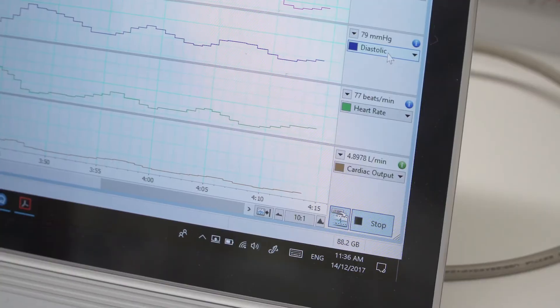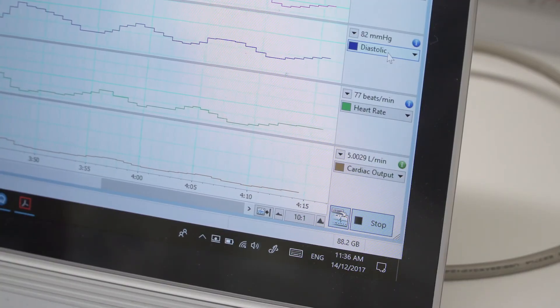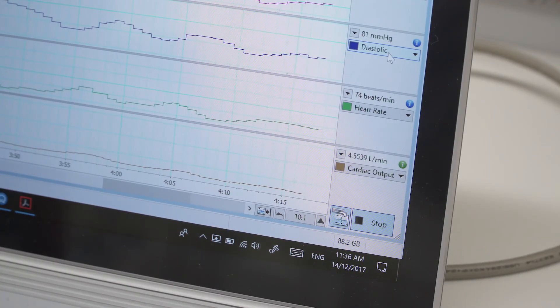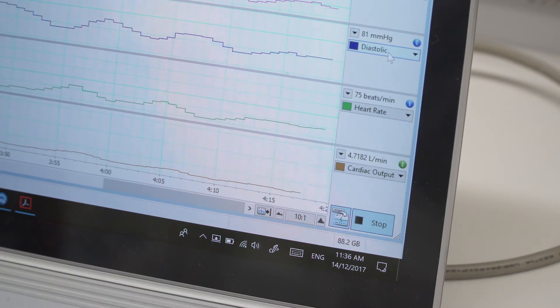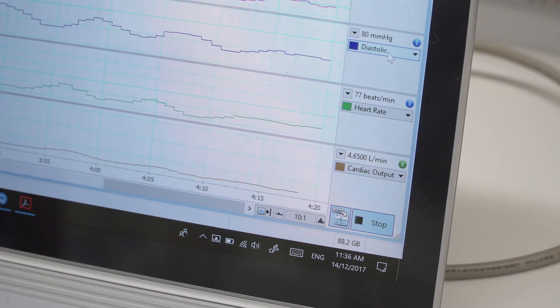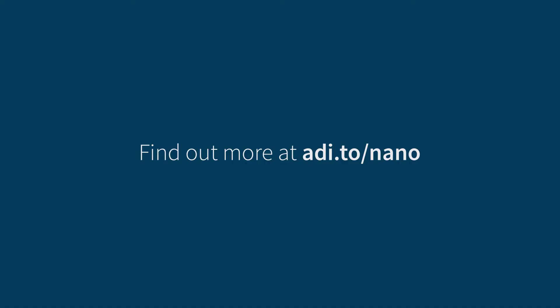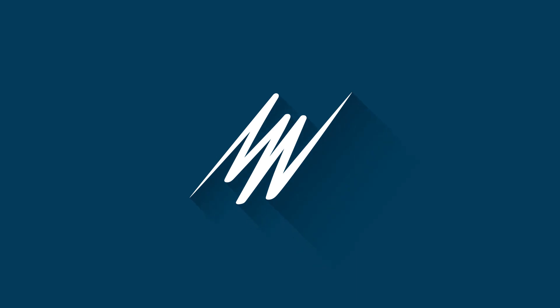The new feature is displaying here in that bottom channel. You can see an online real-time calculation or estimation of cardiac output.